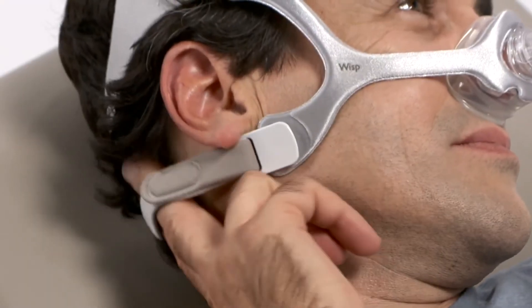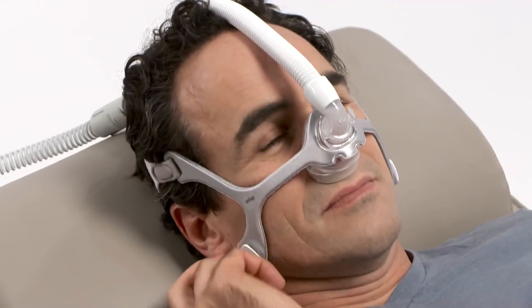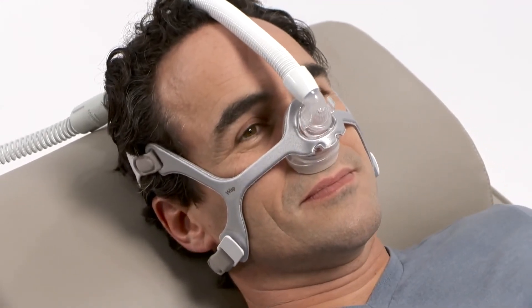Overtightened headgear is a common cause of leaks. Remember, not all leaks have to be corrected when using a Philips Respironics therapy device.